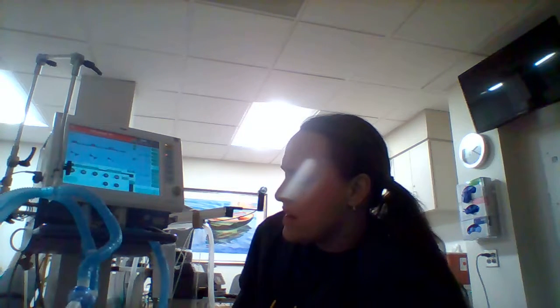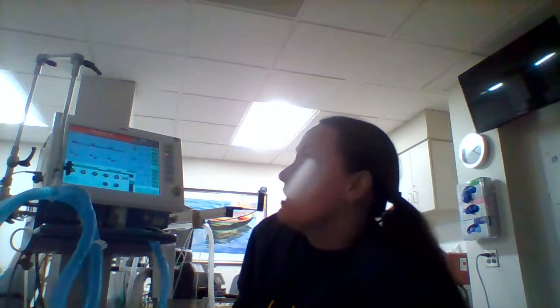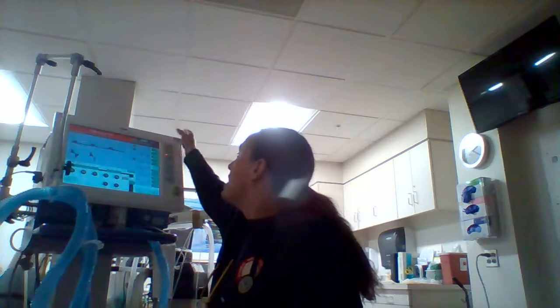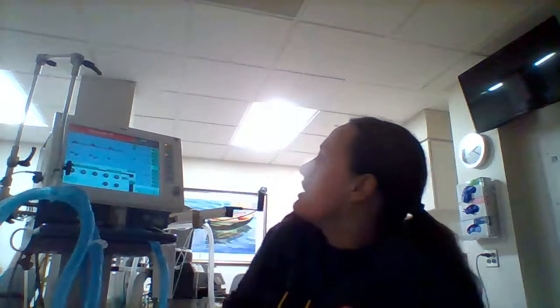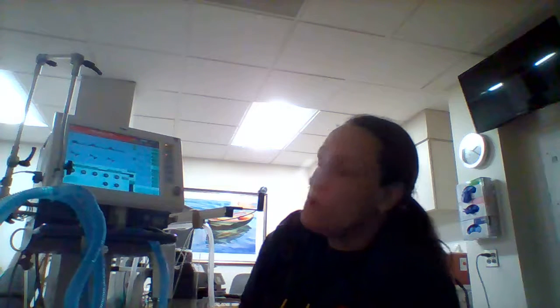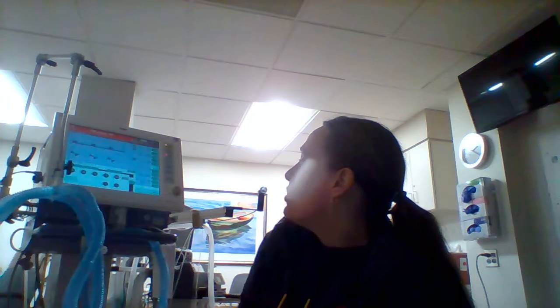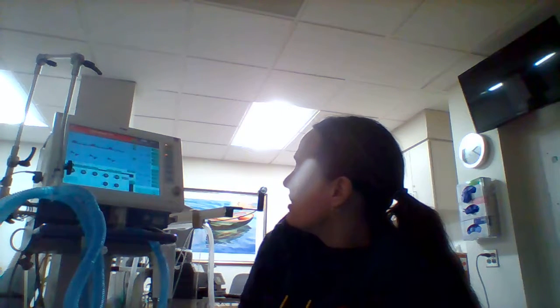They do vent checks here, I think, every 4 hours, and do ABGs anytime they do a change, usually within about an hour. And they also do them, I think, at the end of each shift. And they do 12-hour shifts here, so at least twice a day. More often if they actually do changes, like change the settings, and anything like that.